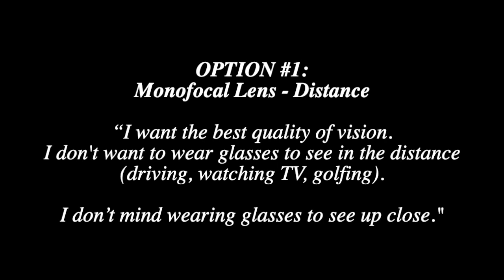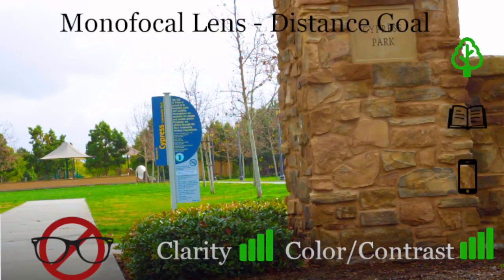This is for a patient who says, I want the best quality of vision. I don't want to wear glasses to see in the distance, things like driving, watching TV, or golfing, but I don't mind wearing glasses to see up close. This lens will return your vision back to when you're 45 years old. The distance will be nice and clear without glasses, wonderful clarity and contrast in color.